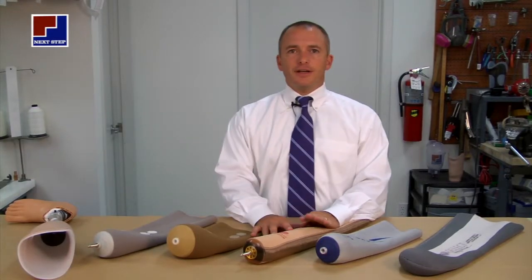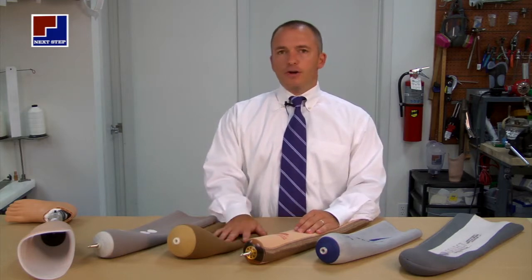Hi, I'm Michael. I'm the prosthetist here at Next Step Orthopedics Orthotic and Prosthetic Lab. And today we're going to go over gel liners for a below-knee prosthesis.